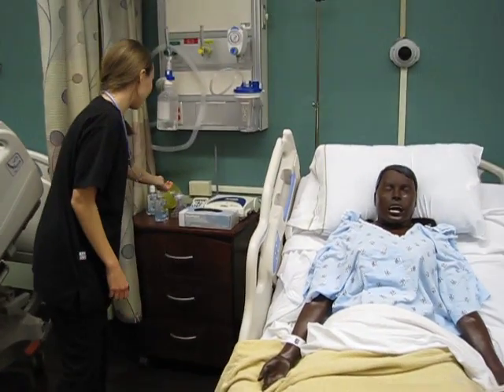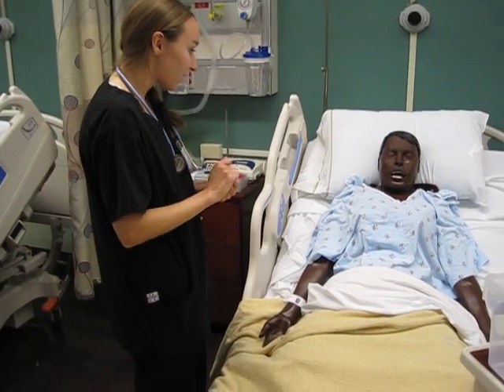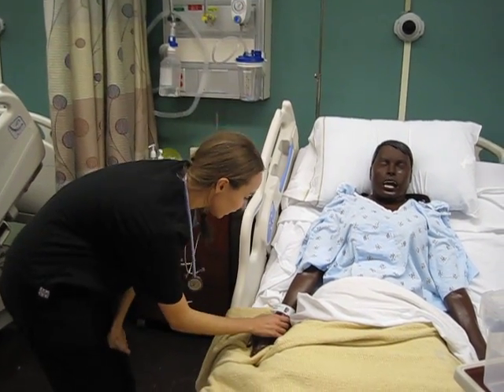Hi, Mrs. Anderson. My name is Caitlin Bierzell. I'll be your student nurse today. Before we begin, I'm going to go ahead and just verify a few things. So can you state your name?